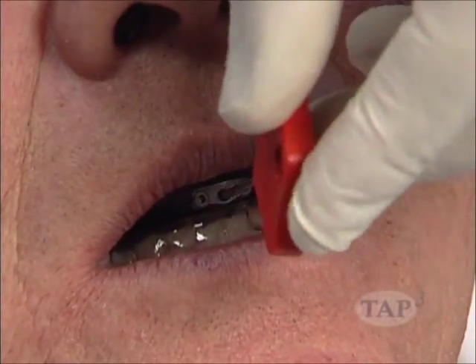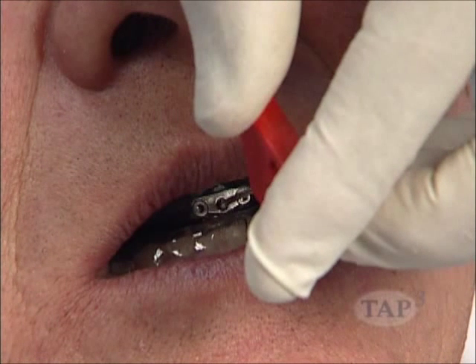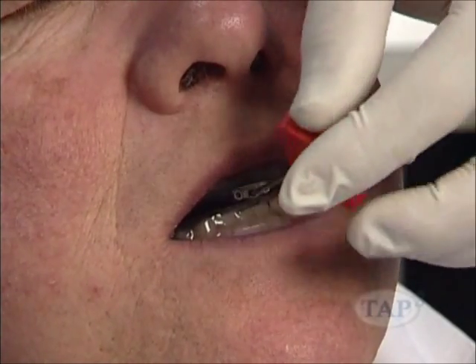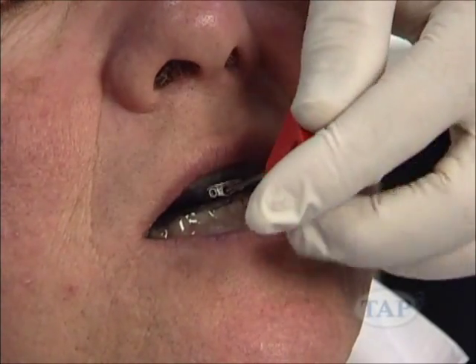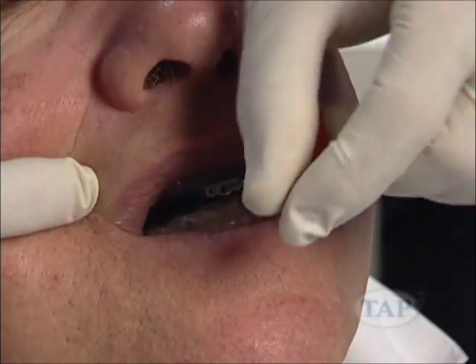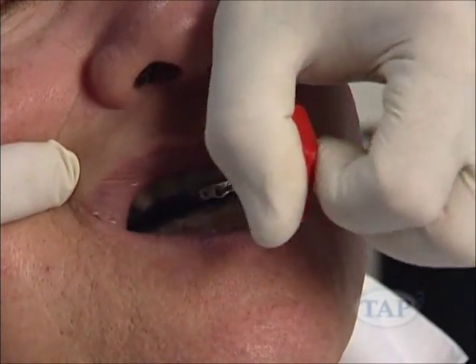Have the patient turn the adjustment key a half turn forward or 180 degrees per night towards their left shoulder until symptoms are relieved. If any position becomes uncomfortable, instruct the patient to dial the hook back or towards their right shoulder until they are comfortable again. If the patient is still experiencing discomfort, have them make an appointment with you for an assessment of their tap.